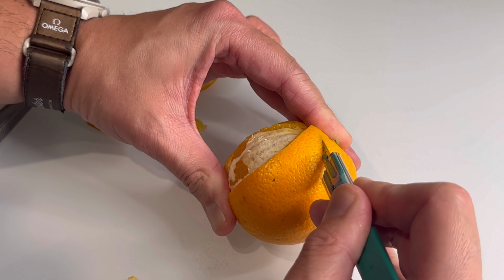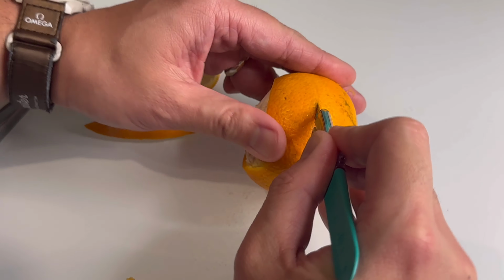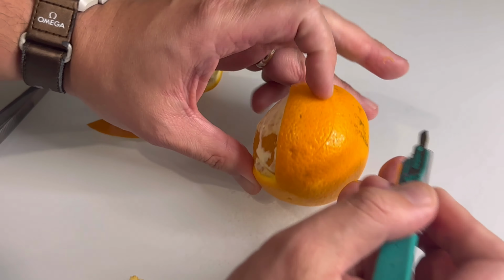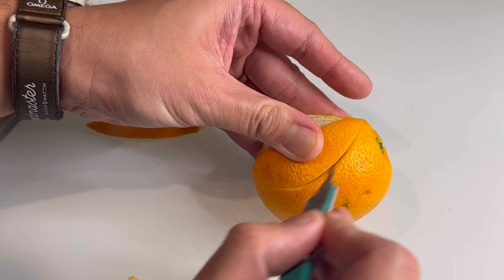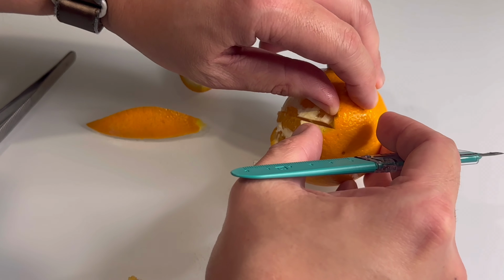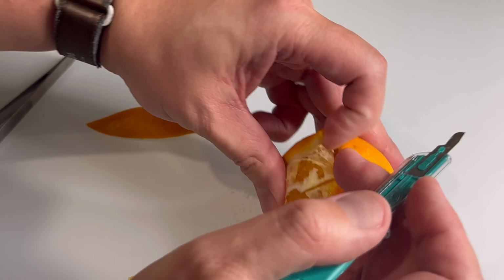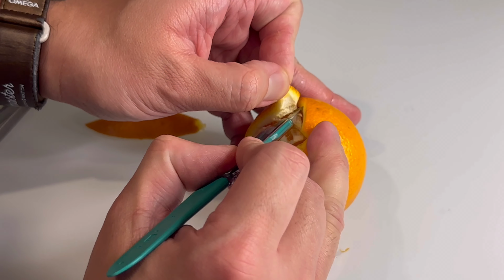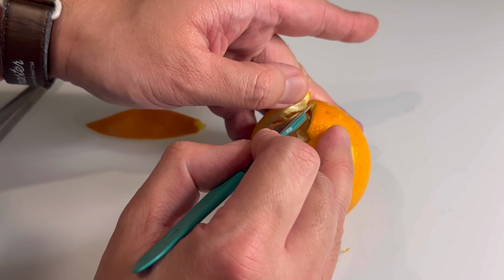So we're going to cut it again down here. There we go. And so we're going to lift this up. You could see that one. You could see the plane there. And as I lift it up, you could point downward. If you point downward with the knife, it would be more towards your orange.